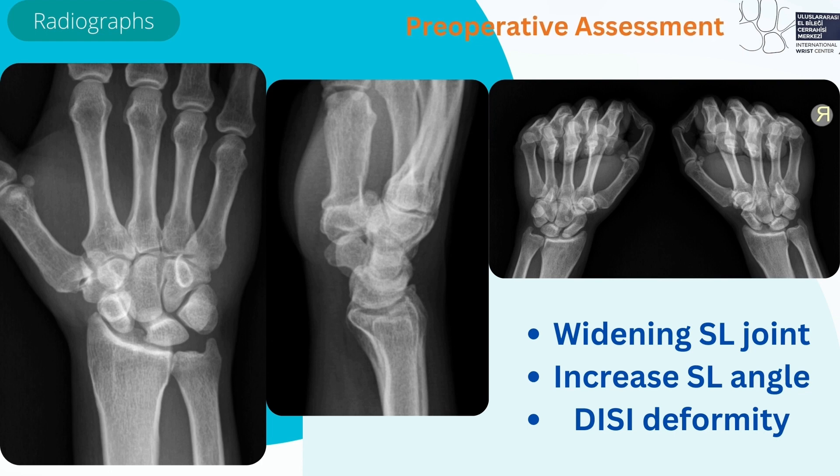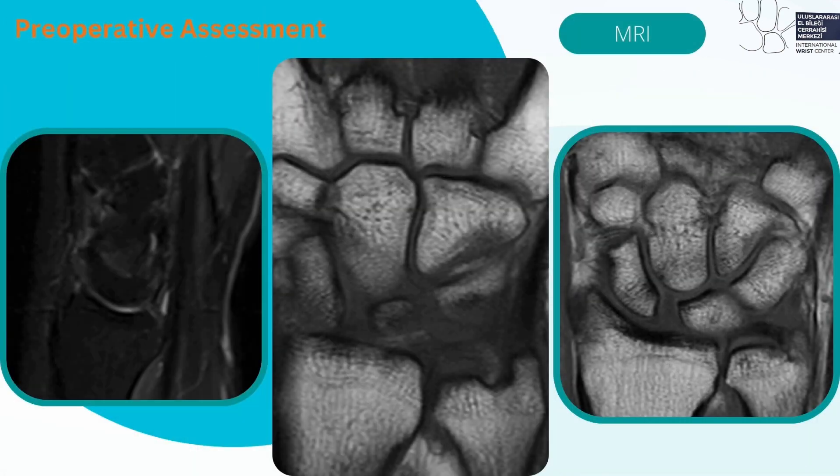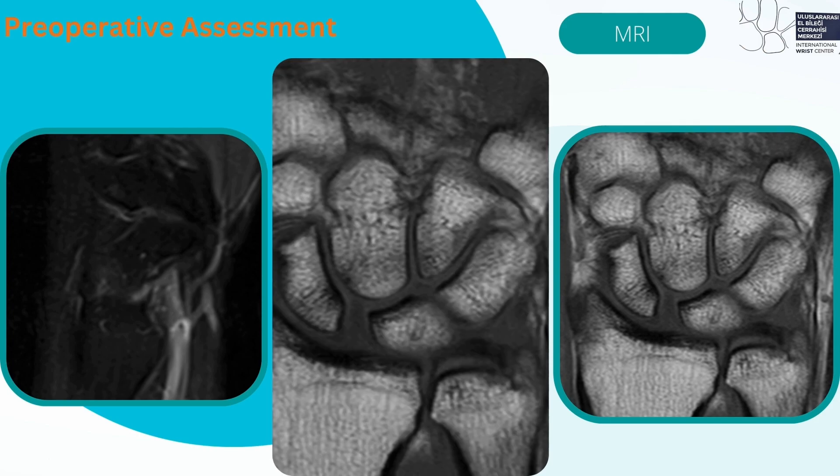Wrist radiograph showing widening of the SL joint and increased SL angle with DISI deformity on the lateral view. CT scan showing no obvious bony changes. MRI showing SL and LT ligament injury and dorsal capsule detachment.